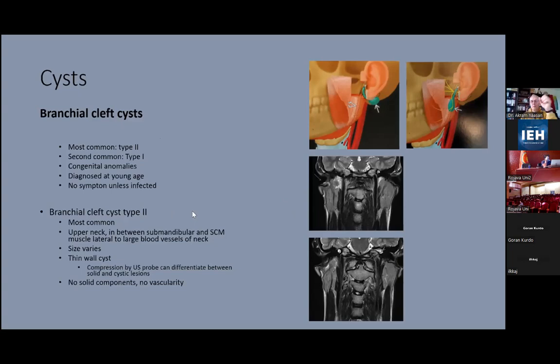This is a patient. These two pictures are of the type 1 branchial cleft cyst. And in this patient, as you see from the external auditory duct, you see a duct which comes to the parotid gland and forms a sinus and goes to be under the skin, like this one. These are the changes. There are small changes in the ultrasound. You see just a small cystic change there. So you need more examination, investigation, for example, MRI.